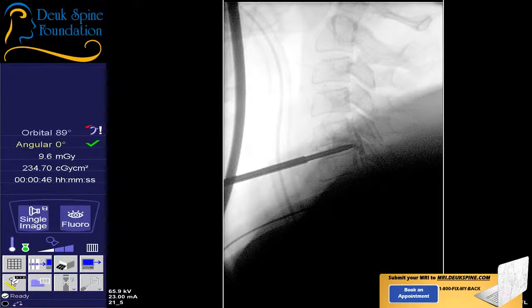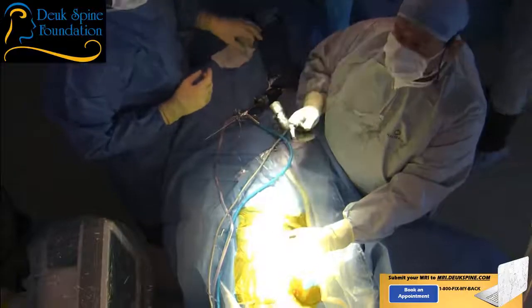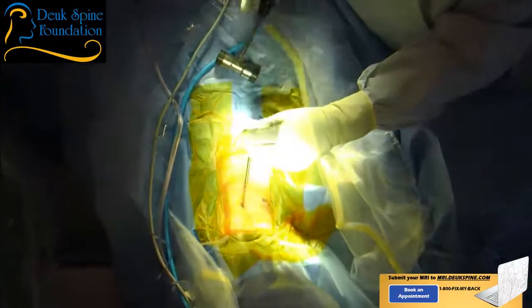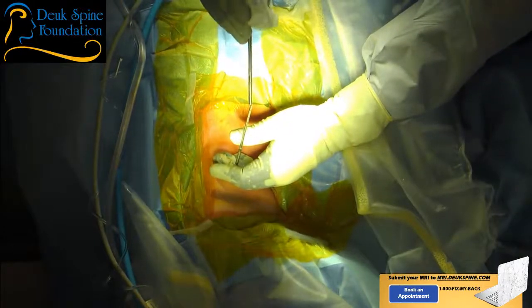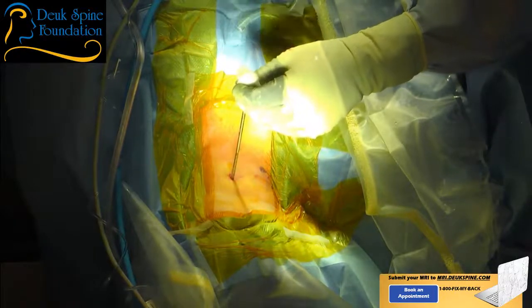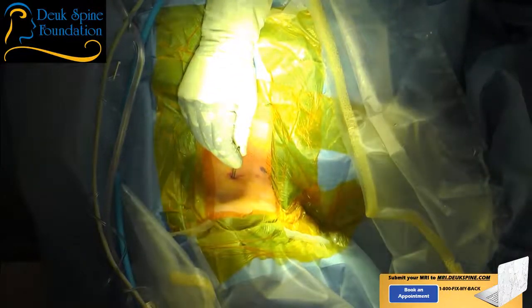So there's less trauma. By the way, if you've ever heard of anybody having a neck fusion through the front, all those people have trouble swallowing. The reason is the surgeon has to move over the trachea, the esophagus, all the soft tissues. We have to cut not through them, but around them. That causes inflammation in those tissues, and because of the inflammation and trauma from the surgery, they have a sore throat, trouble swallowing, and sometimes hoarseness that goes on. By doing the laser surgery, endoscopic, we don't have any of those problems. This patient won't have a sore throat, hoarseness, or trouble swallowing because the surgery was done endoscopically.